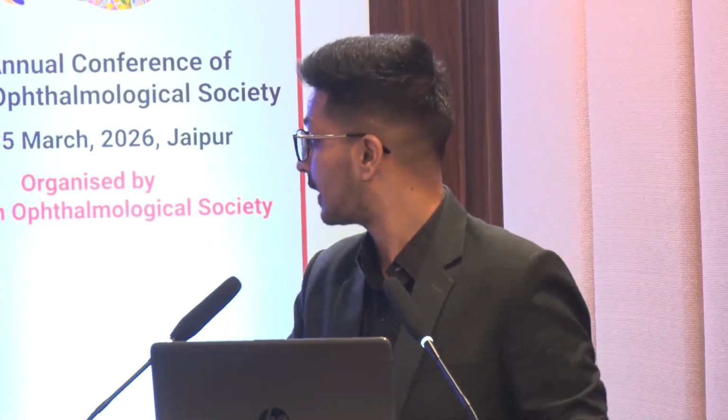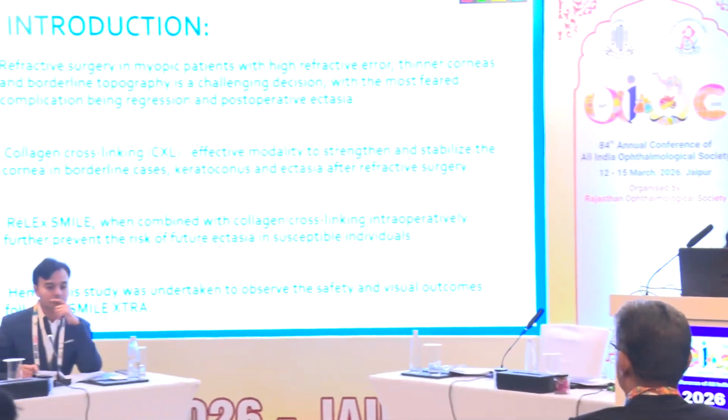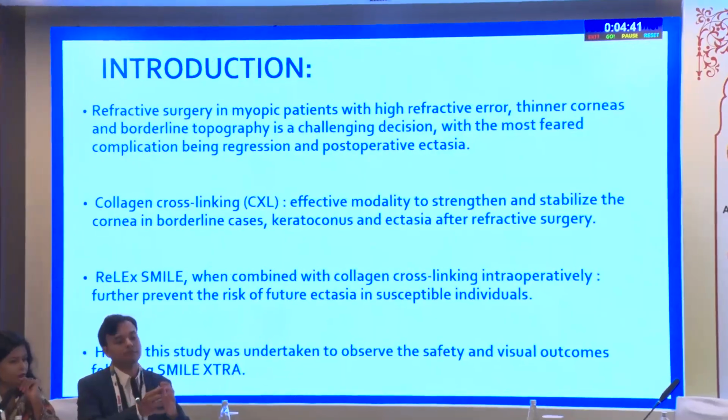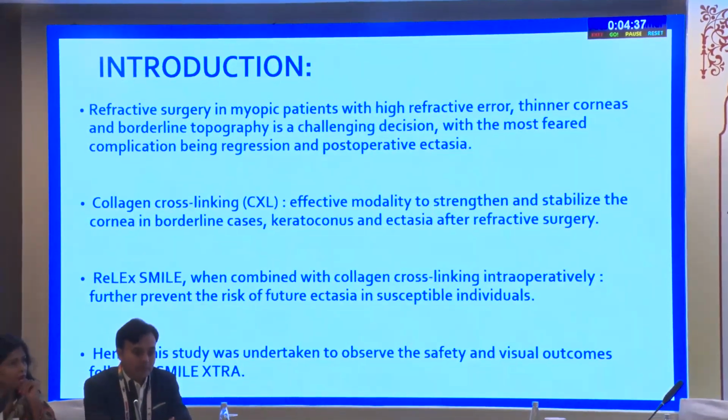I'll start my topic, Smile Extra procedure and advanced approach integrating lenticule extraction and corneal cross-linking for refractive correction. Refractive surgery in myopic patients with high refractive error, thinner corneas and borderline topography is a very challenging decision, with the most feared complication being regression and postoperative ectasia.